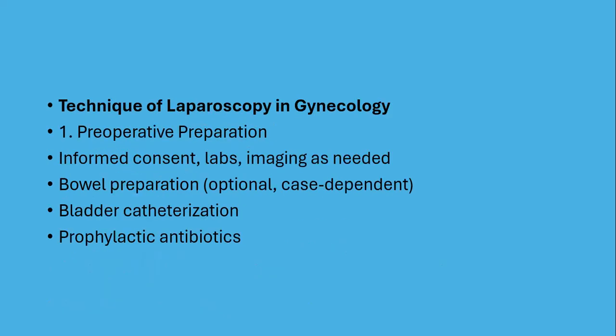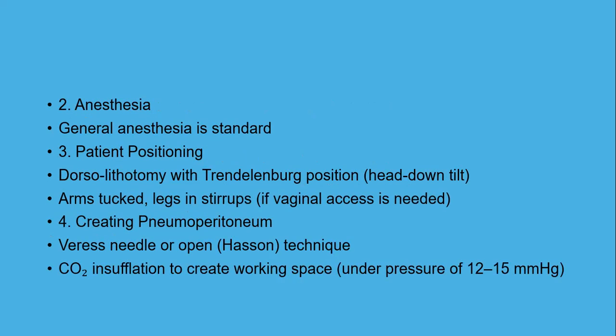Technique of laparoscopy in gynecology. 1. Preoperative preparation. Informed consent, labs, imaging as needed. Bowel preparation, optional, case dependent. Bladder catheterization. Prophylactic antibiotics. 2. Anesthesia. General anesthesia is standard. 3. Patient positioning. Dorsolithotomy with Trendelenburg position, head down tilt. Arms tucked, legs in stirrups, if vaginal access is needed.